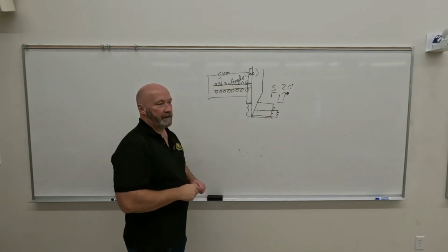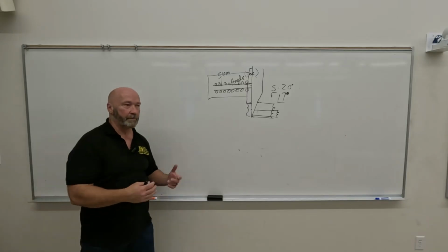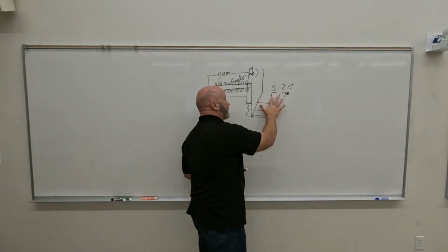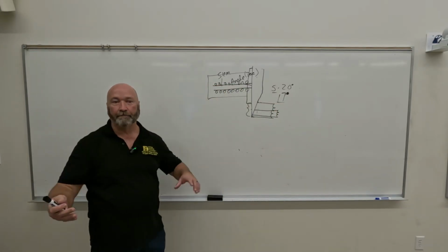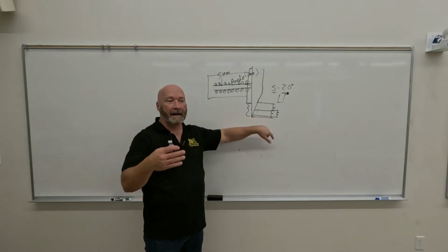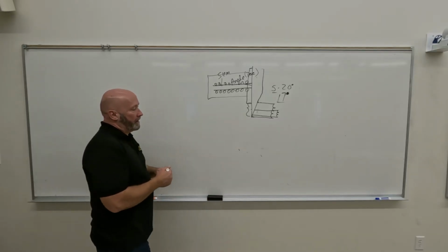Those are, again, special procedures tubes. You're probably not going to work with one of those unless you work in special procedures, cardiac cath lab or something like that. So that's what we refer to as a bifocal tube, or bi-angle anode. I'm sorry. Any tube with 2 filaments is a bifocal tube. That'd be a bi-angle anode. Okay. So, all right.